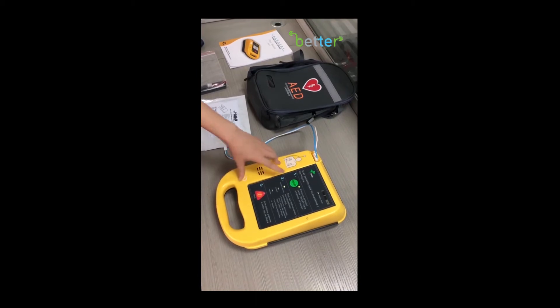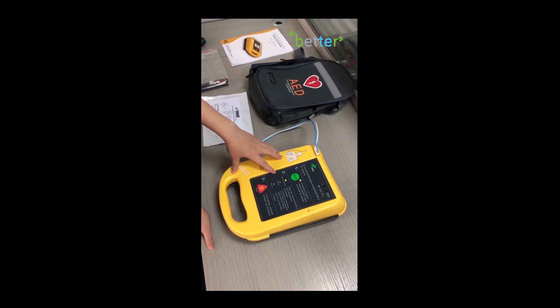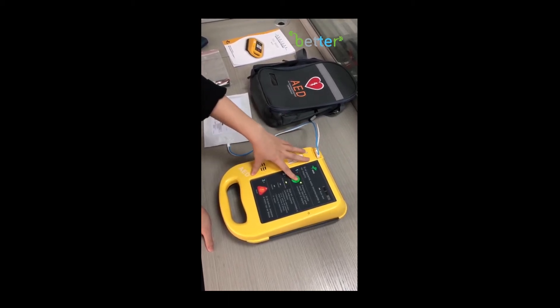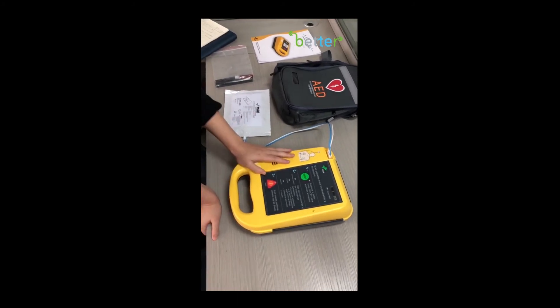And it works. The device announces: 'Verificar electrodos.' Finally, just press the button again — 'Verificar electrodos' — and it shuts down.